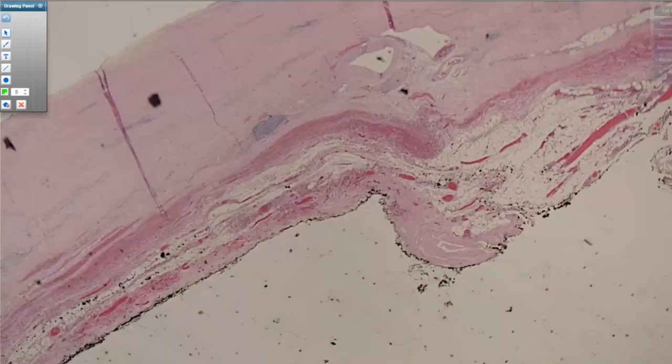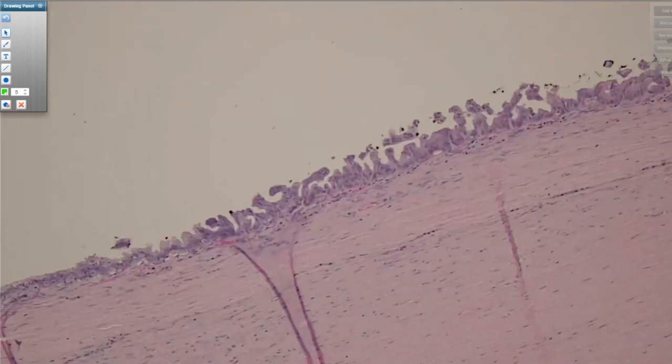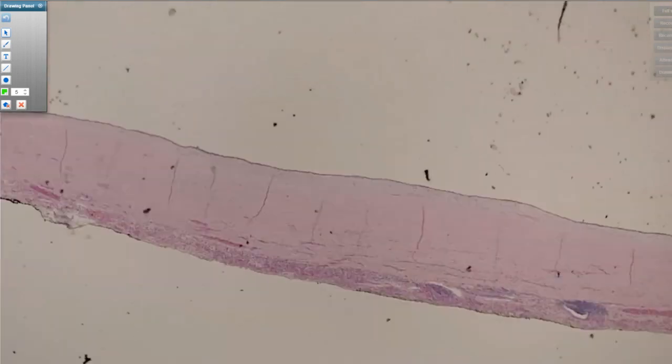This is just an example of where the high-grade dysplasia was fairly focal and abrupt. So you go along, have your nice, flat, barely even mucinous lining, and then all of a sudden you have lack of polarization, these tiny little micropapillary formations, fusion of adjacent little buds, and so you have very abrupt high-grade dysplasia within an MCN.